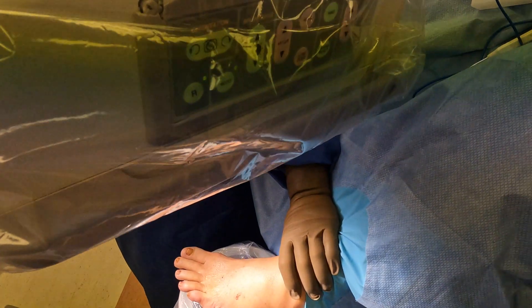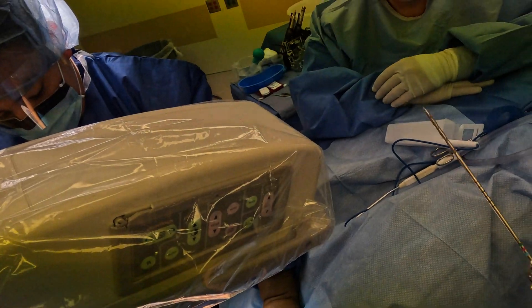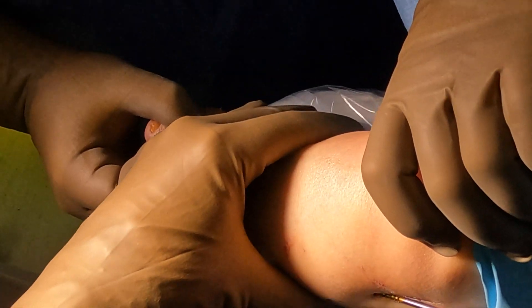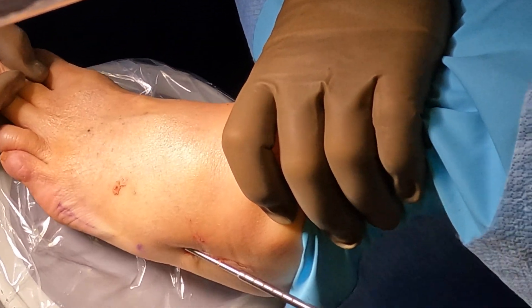We're going to drill the metatarsal bone — using a regular drill down the metatarsal shaft. The next step is to tap the screw threads, just like carpentry. We're tapping the bone with a threaded tap, getting it ready for the screw.